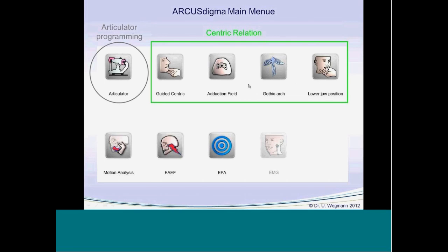You can prefer the guided centric with a Lauritzen grip, for example, or the adduction field, or the Gothic arch tracing, especially for full dentures. And there's a new one, it's called lower jaw positioning, and that's what I prefer to have for the centric position when I treat functional diseases.